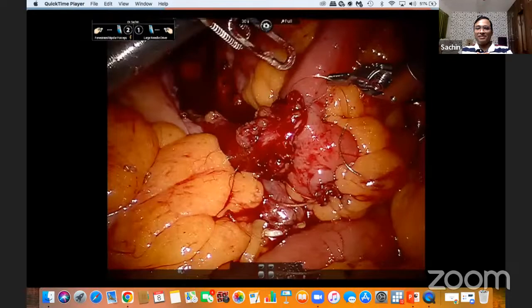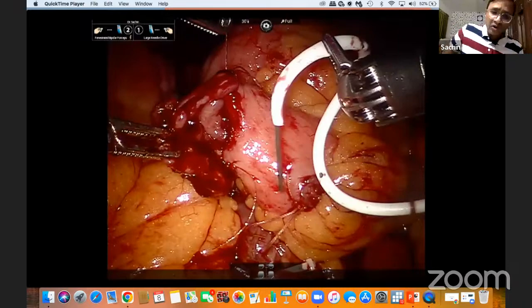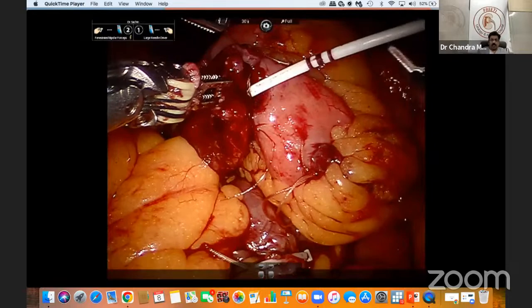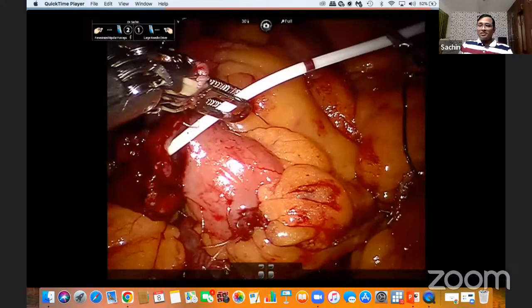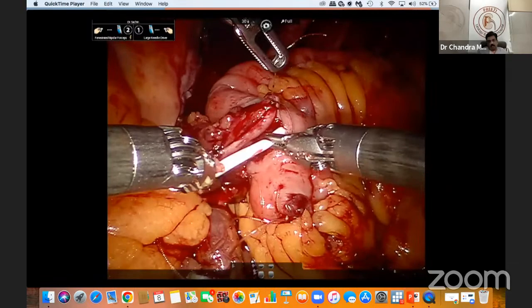Yeah, very nicely done. So, next step is to put a stent. I usually use a double J or a single J stent. Sometimes double J or sometimes single J. Double J, most of the time it falls off on its own. Why are you not using the suction cannula directly into the ureter? I'm not used to this. What suction? That suction. It will push directly into the ureter and you can push. Robotically, I think it's not required. This is also sometimes a difficult job for beginners.